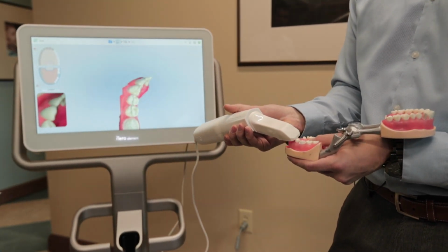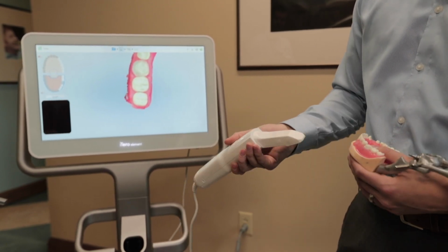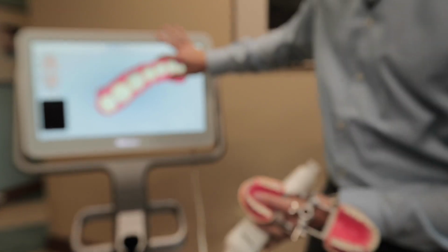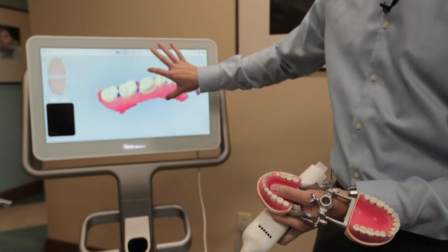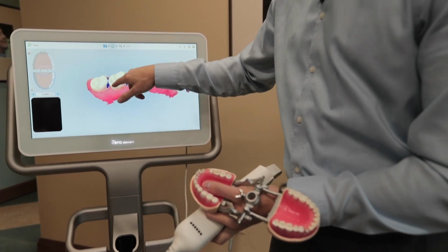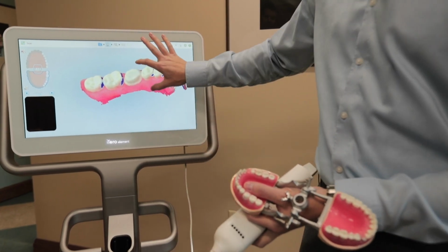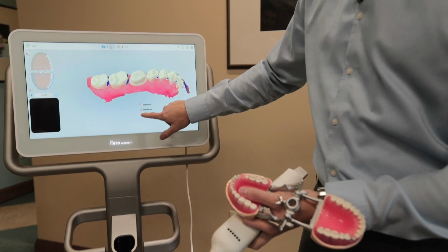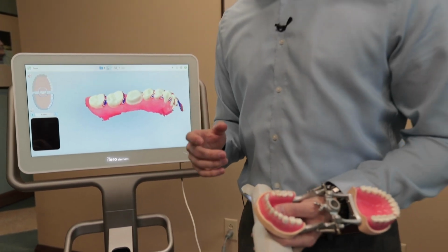Now here, what we want to make sure is that we get our contact points, okay? So I'm just going to turn it off real quick. Take a glance, and we are missing some of our contacts, all right? So we're missing our distal and our mesial contacts. So we want to go in and clear those. We don't have to worry about our interproximals on the other teeth because that's not going to affect the fit of the crown, but this is surely going to affect the fit of that crown. We want to make sure we have a nice contact. So we're going to hold down the screen. We're going to hit this fill tool. What fill does is it allows you to select just that area to capture data.